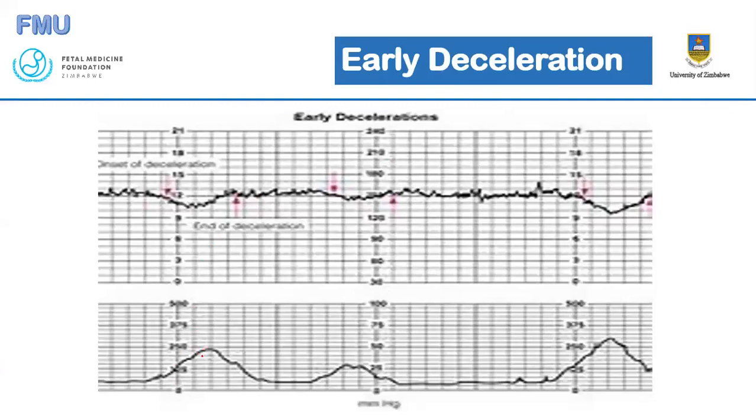Early deceleration means it starts with a contraction and ends with a contraction, so that if we draw the trough, it almost corresponds to the peak of the contraction. Probably this one may not qualify as a deceleration. This one is a deceleration there.